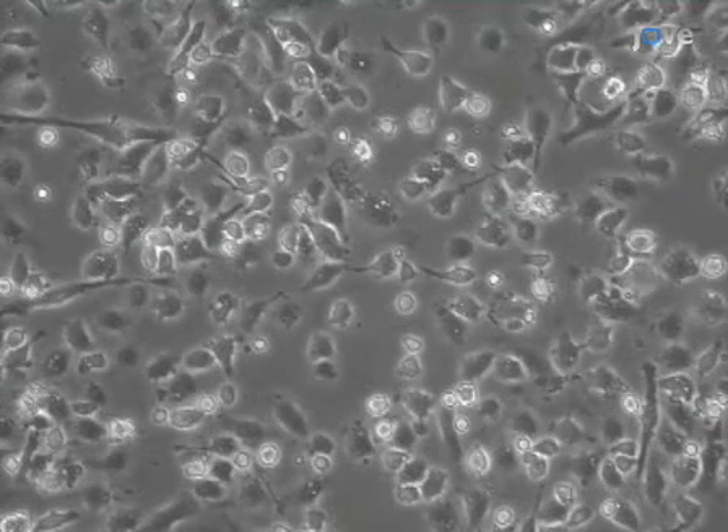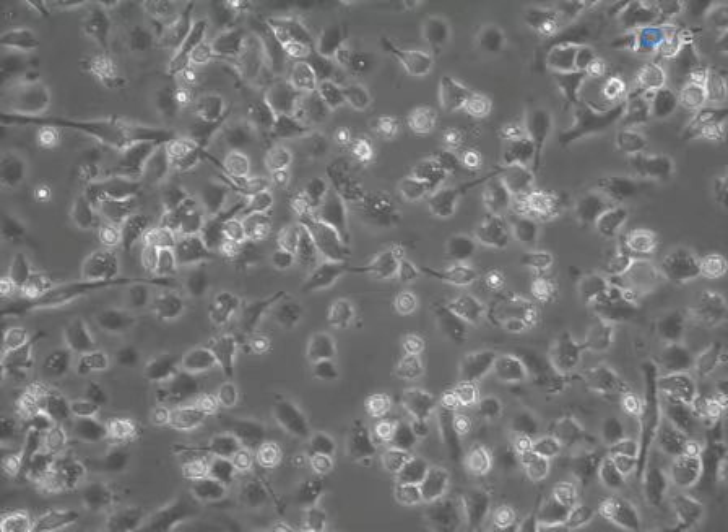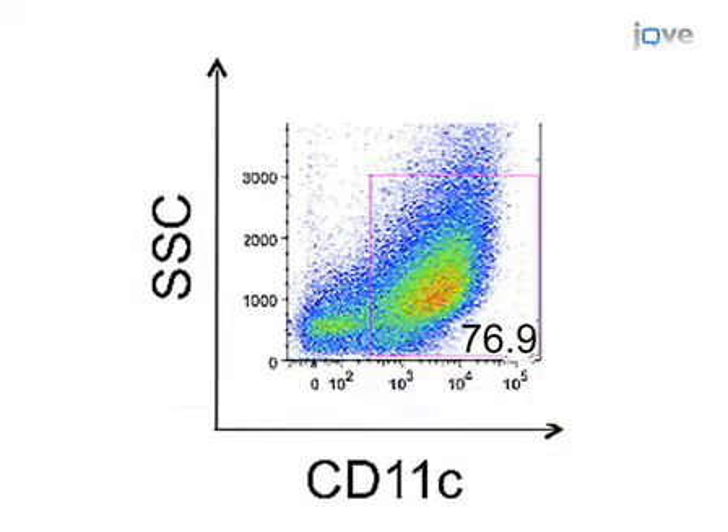This is what the cells look like on day one of culture just after plating. Note that the cells are small, round, and non-adherent. After seven days of culture, many but not all of the cells have adhered to the dish, and several have developed obvious dendrites. Under these culture conditions, typically 70 to 90 percent of harvested cells are CD11C positive. At this point the cells are differentiated but relatively immature.